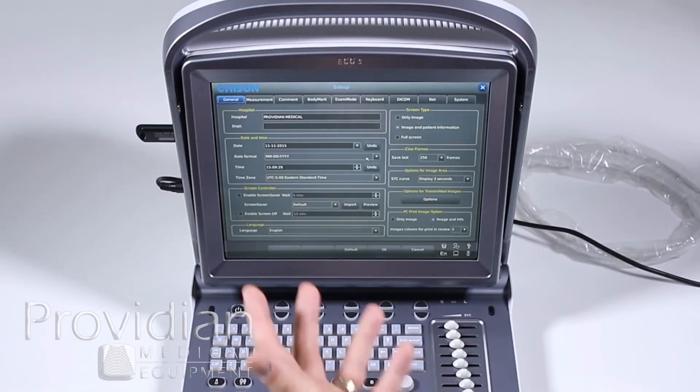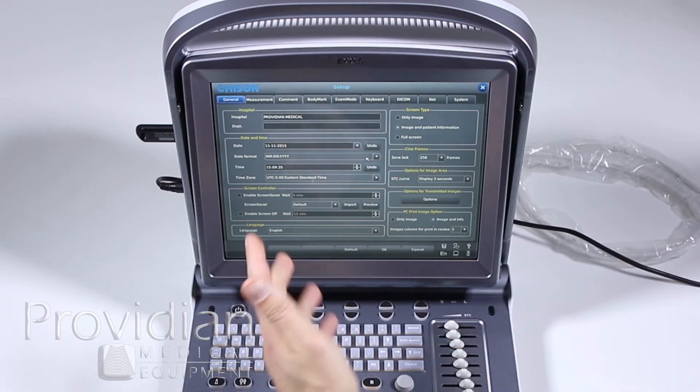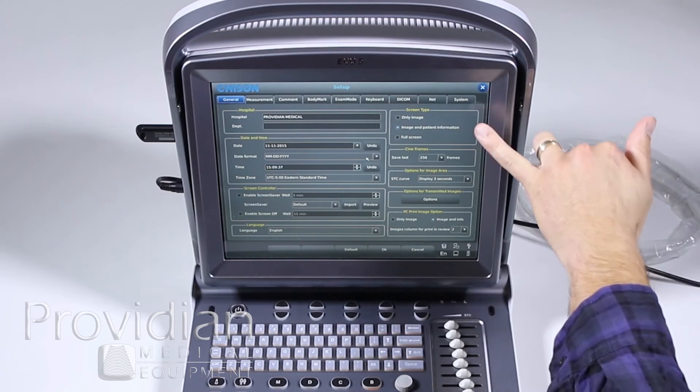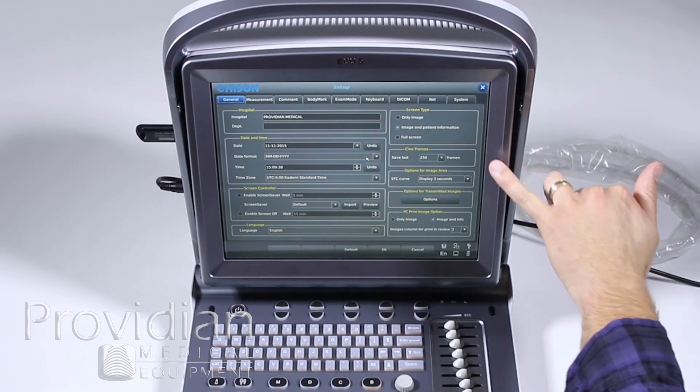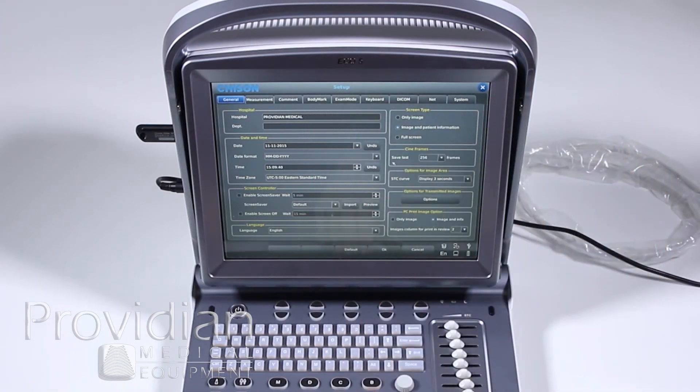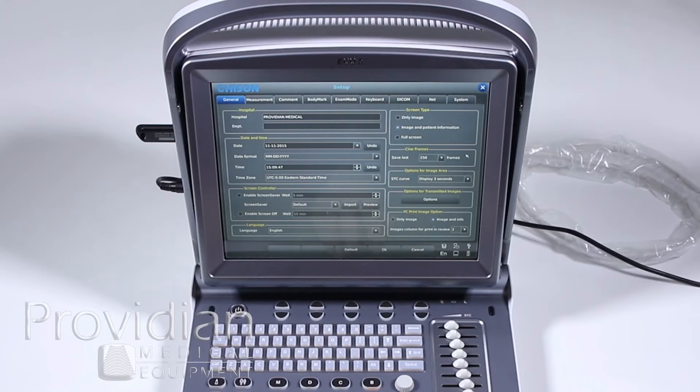And here is the most basic stuff where you can know your hospital name, change your date and time, your time zone, if you want a screen saver, screen type, how much information you want on the screen. That cine loop where I said there was up to 256 frames, you can set it to a shorter time frame or you can set it to a number of seconds, like 10 or 5 seconds.